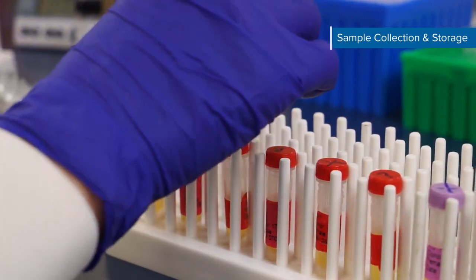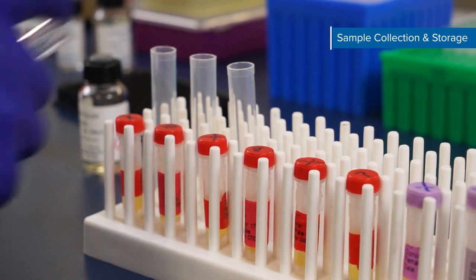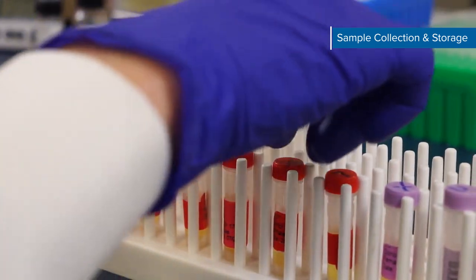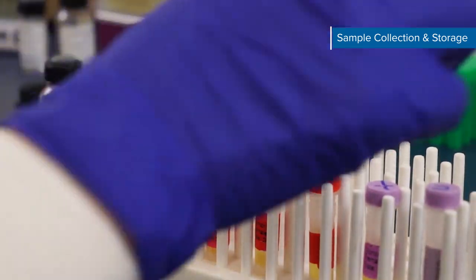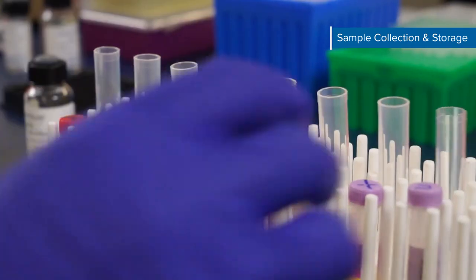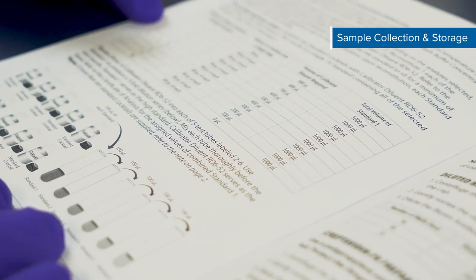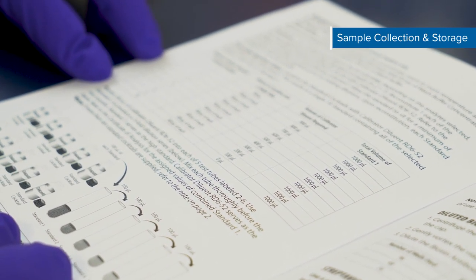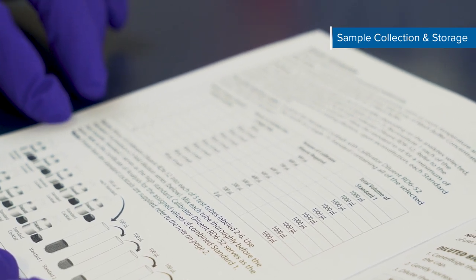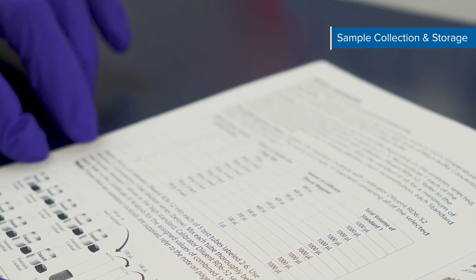It's best to collect your sample right before you begin, but samples can be stored. If you must store your sample, freeze in single-use aliquots and refer to your kit booklet for specific collection, processing, and storage instructions. We recommend avoiding repeated freeze-thaw cycles. Once samples are ready, it's time to prepare our reagents.